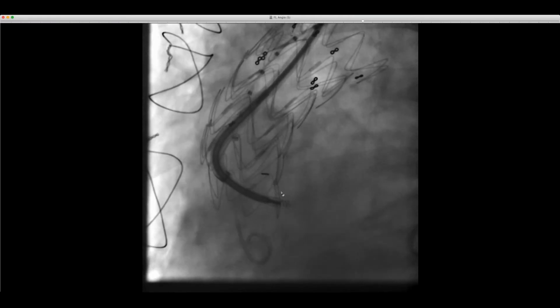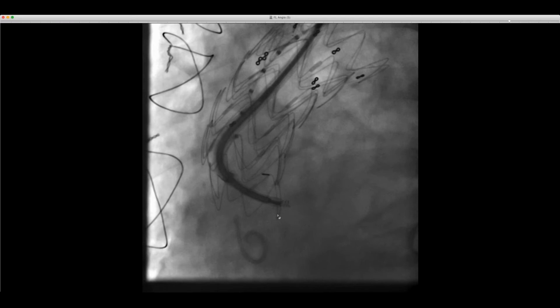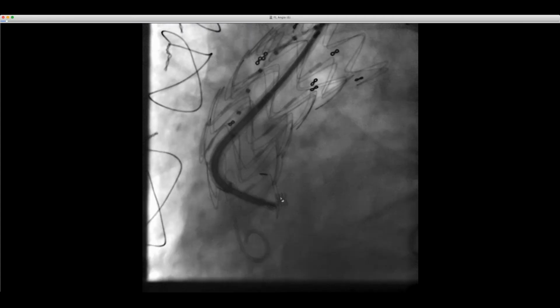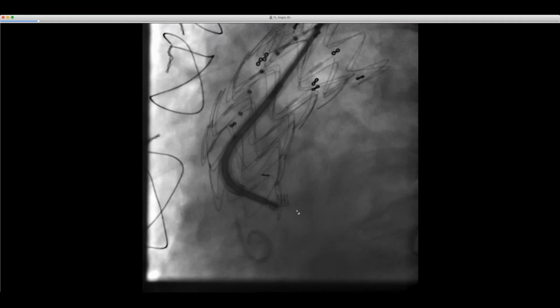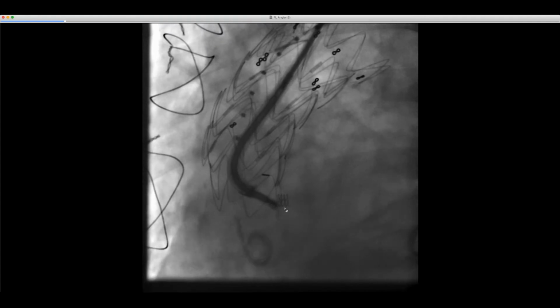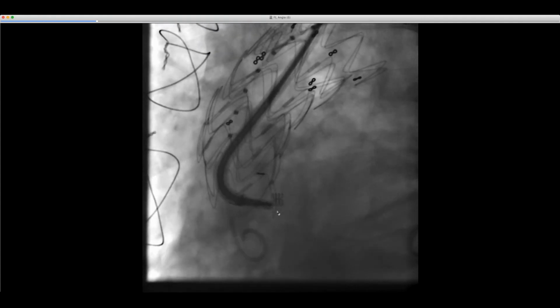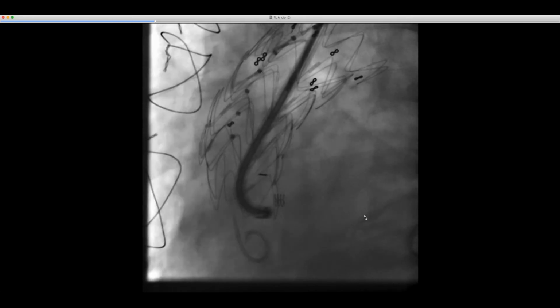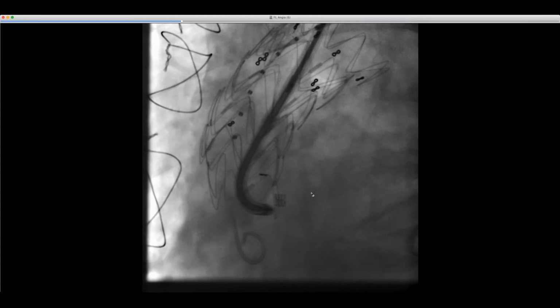So you can see after that anchoring, there's no flapping anymore. I'm not showing the follow-up angiogram. There you can see the endo screws, and normally a couple of these are apparently deployed, where we just have someone who started to do this particular procedure. But you can see that now, after this deployment of 2 endo screws, you have much less movement of that, and it's opposed to the aortic wall there.